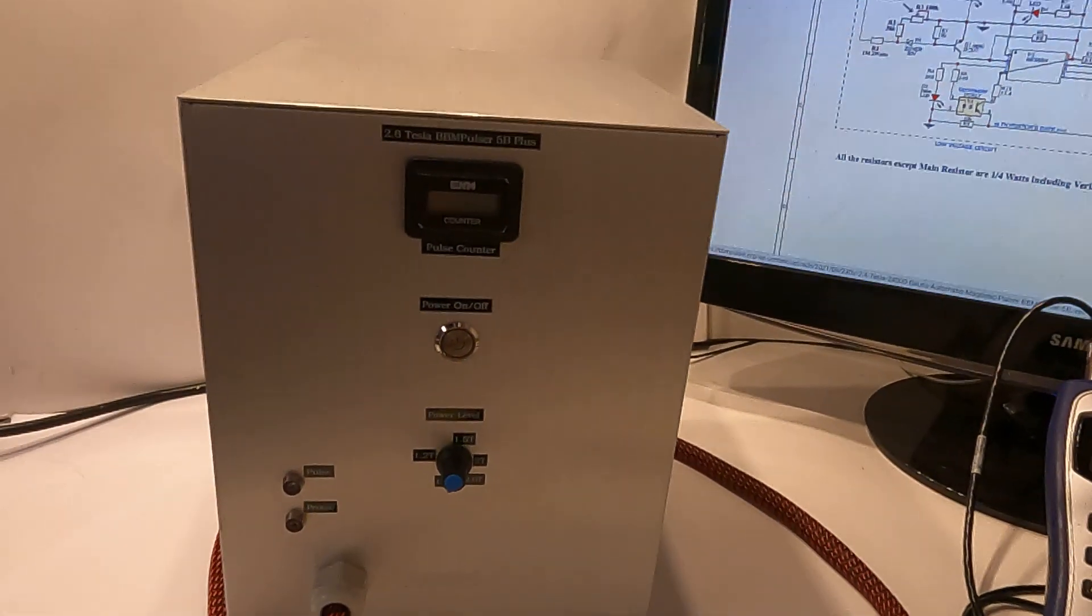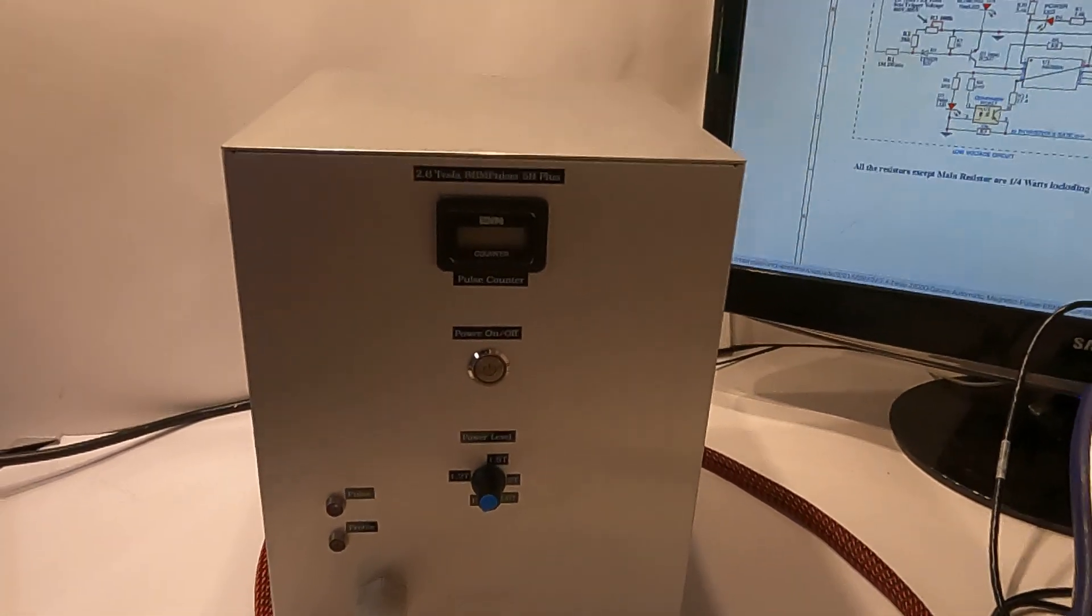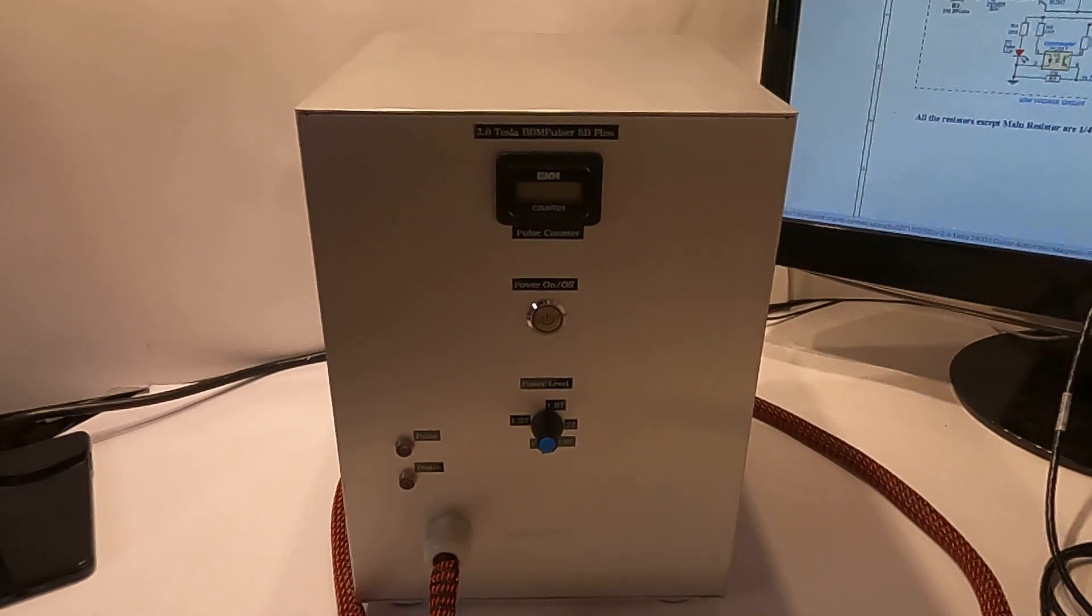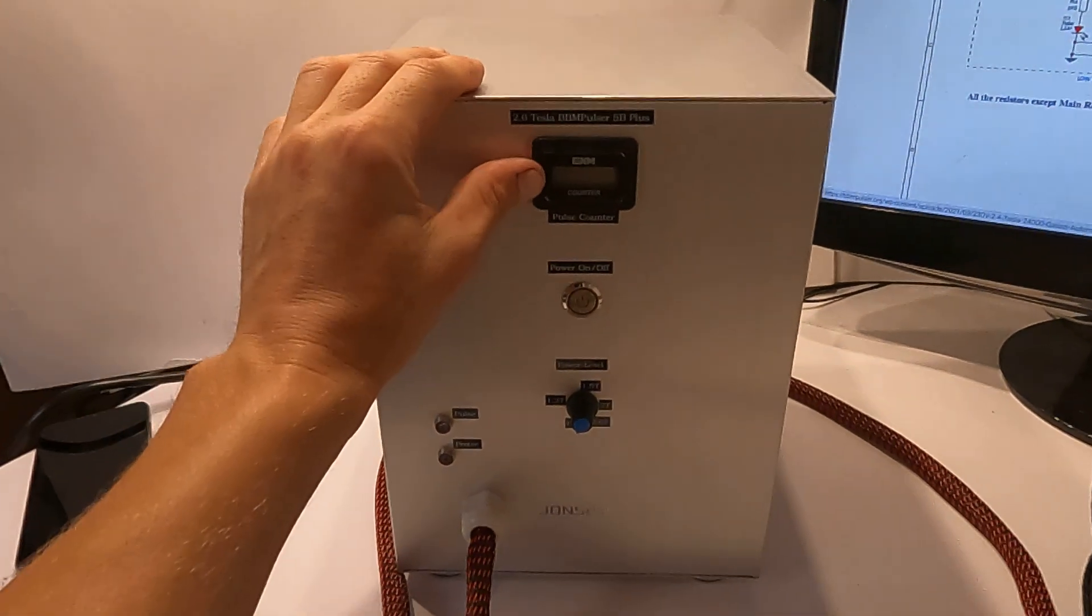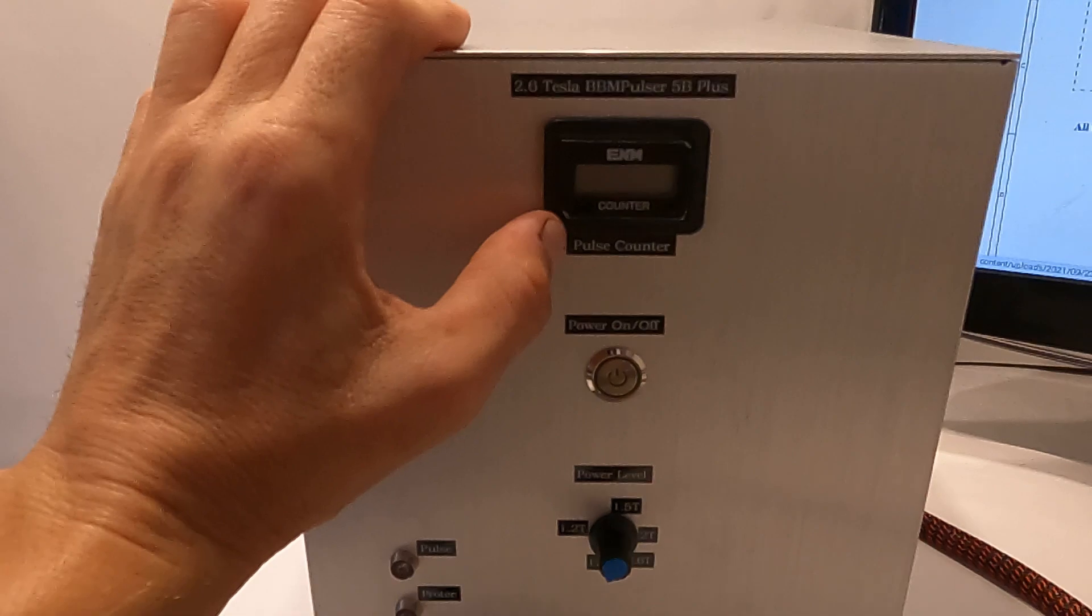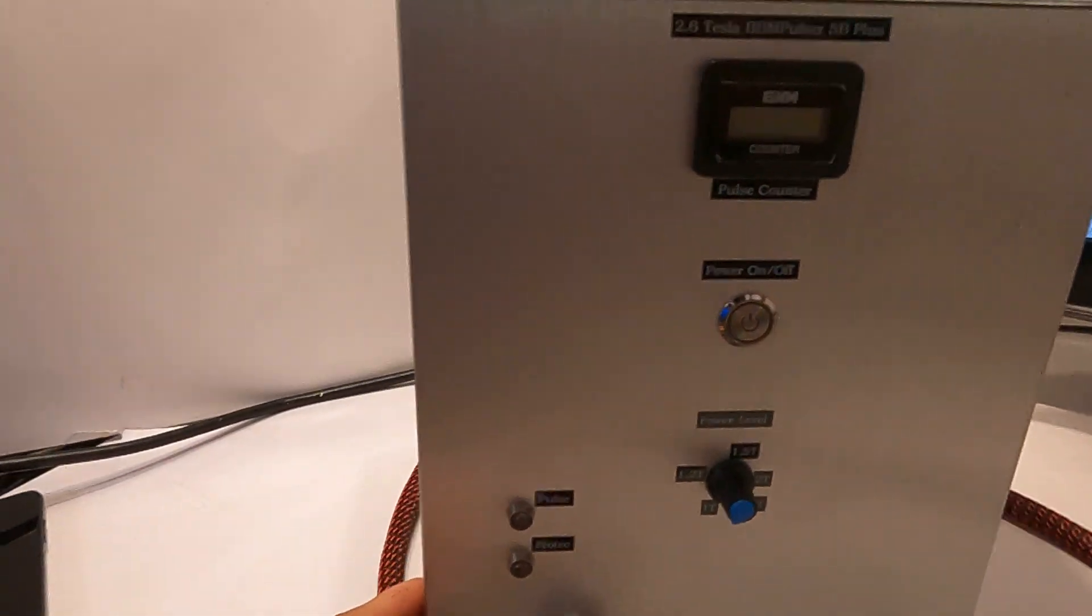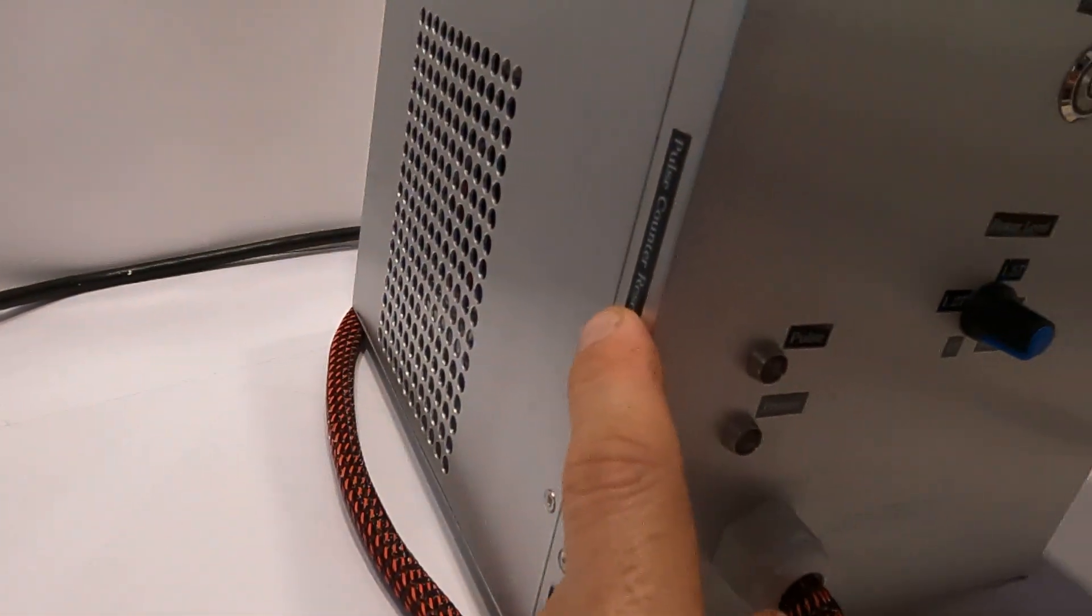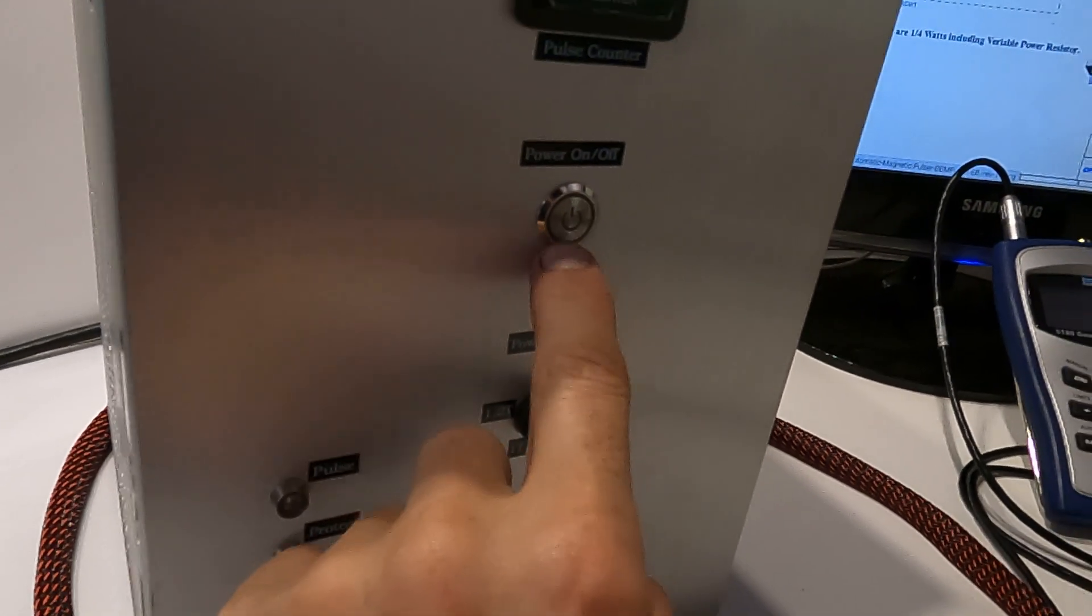Let me go over a few things that I have upgraded. The first thing I added is a pulse counter with a memory. This memory you can reset by pushing this button. It doesn't reset when you power it up.